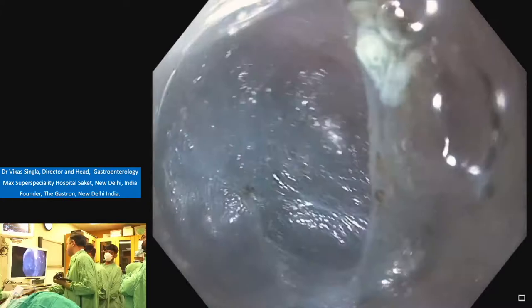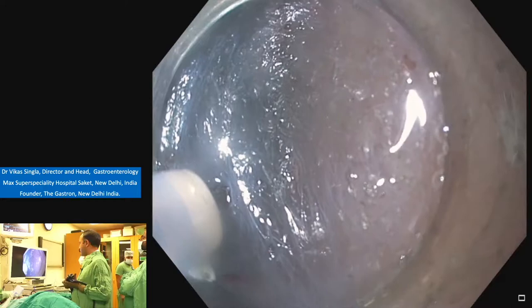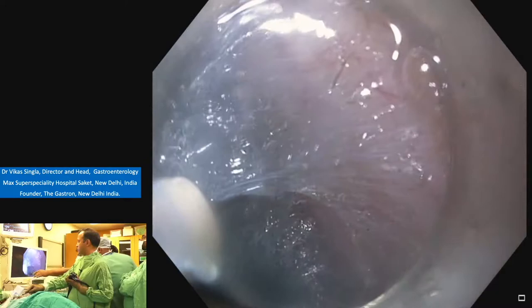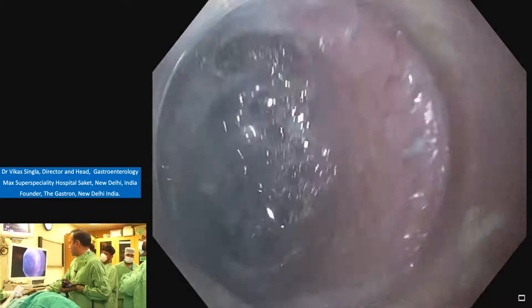And we can see tiny vessel there. Now again, make a hole in the submucosa on one side, engage the fiber and then go towards the other direction. You can see that we are moving towards the other direction. And always the knife should be directed towards the muscle layer. We have to avoid the mucosal injury.